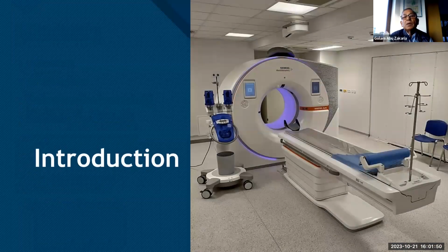This is a machine everybody knows, this computer tomography machine. And this machine is actually an all-rounder in a department. Even when the department is closed, you can see every time the computer tomography machine is there. You do not know when some patient or some accident patient is there. So every time there is an urgent possibility to use the computer tomography machine in the department.